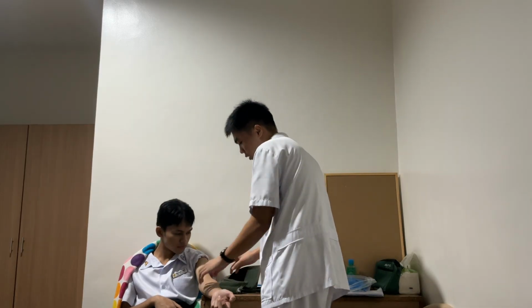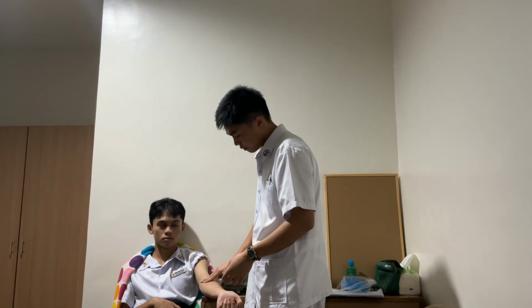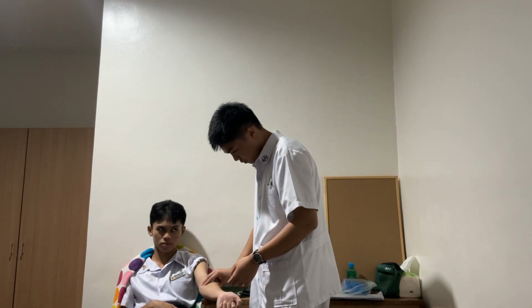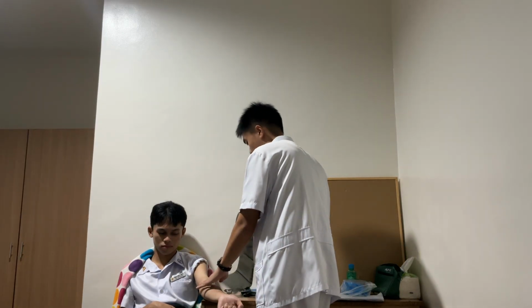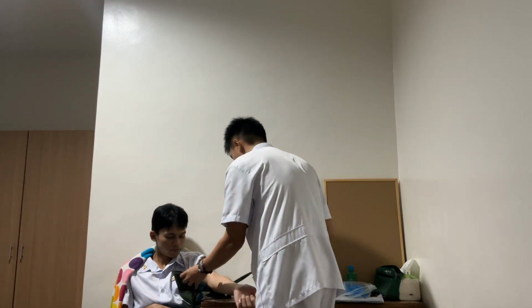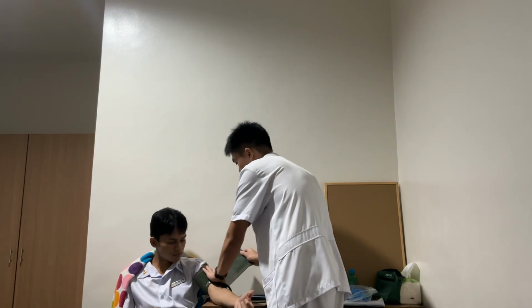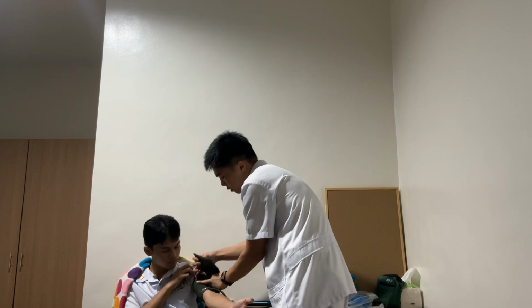So, estimate so that we do not cover the brachial artery. So, I'm just going to find it now. Okay, so I found it. It is the area around here. So we do not want to cover that. Cover that, and then we do not want it too tight or too loose.